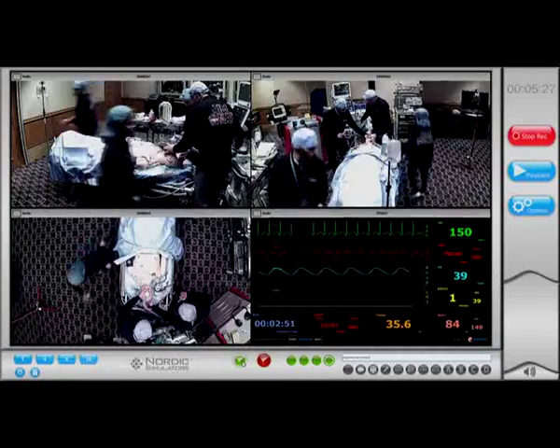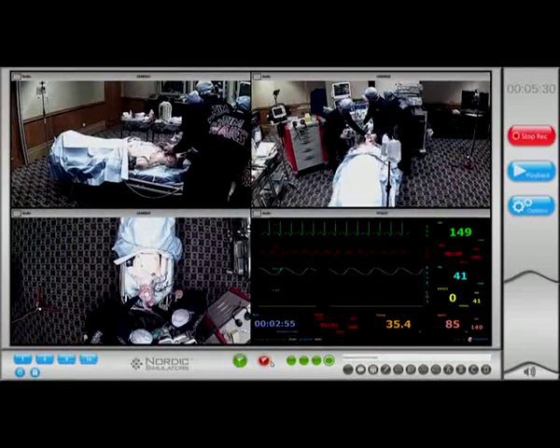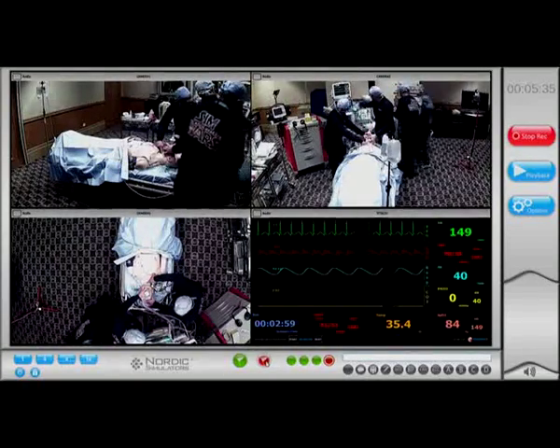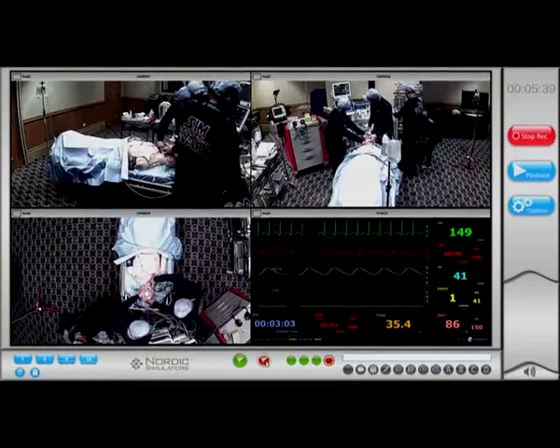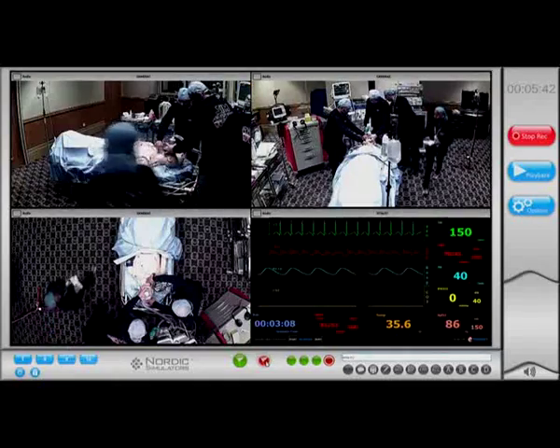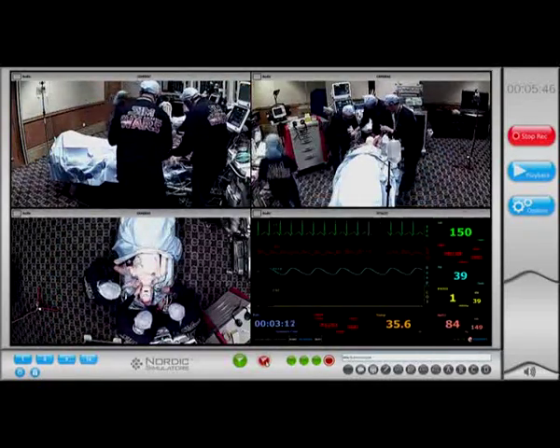Tube ready? Yes, doctor. One second. Go ahead. Hold on. Maybe another IV line. Please measure. Do we still have a pulse? Yes, there is pulse, but the saturation is low. Tube ready, sir. Okay. Inline immobilization? Yes.